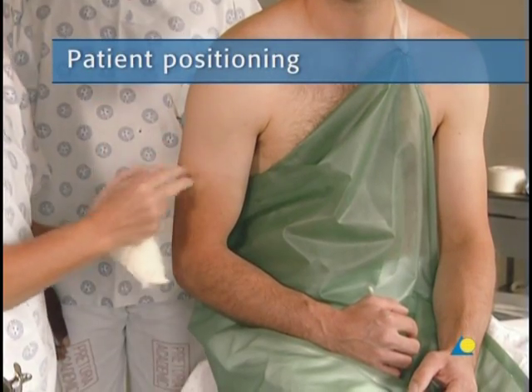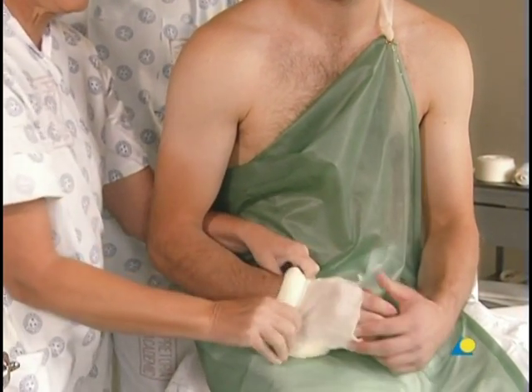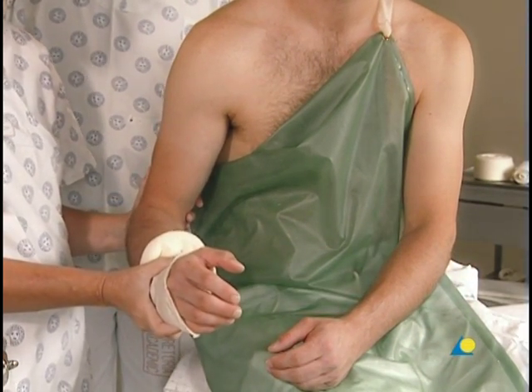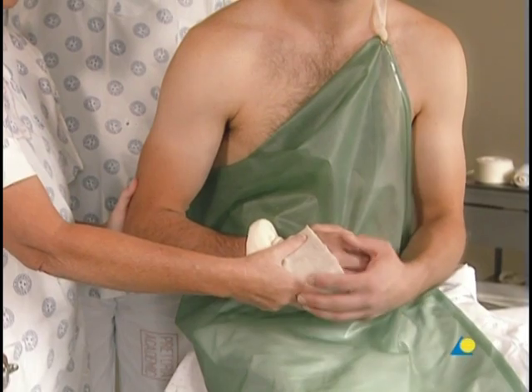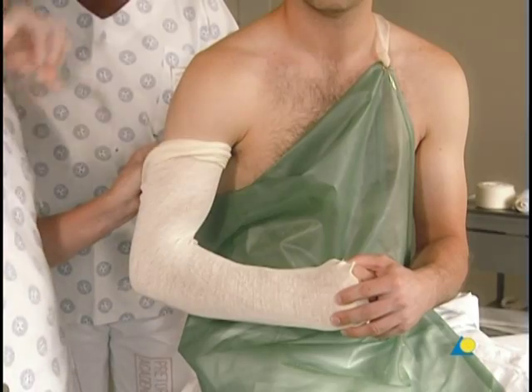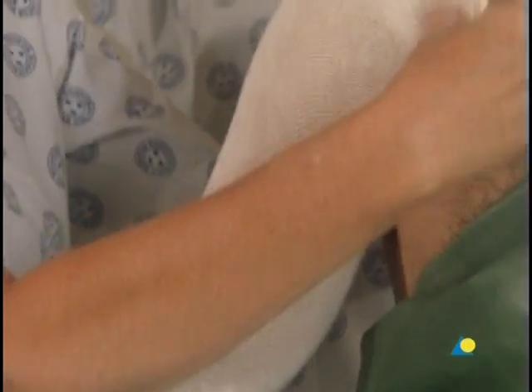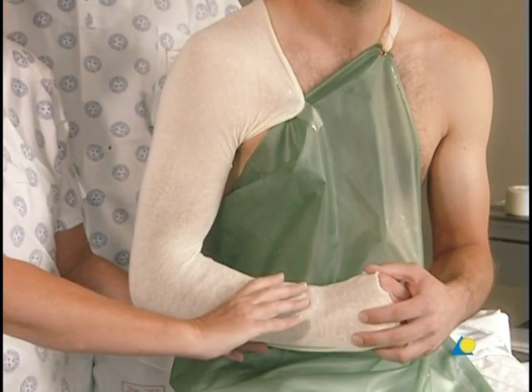The patient should be seated. The patient is told that any feeling of pins and needles or signs of a pinched nerve should be communicated immediately. The splint is applied with the shoulder in internal rotation and the hand in front of the body. The stockinette is applied, and a slit is cut to accommodate the shoulder. The stockinette may be taped in place or held by an assistant. The elbow should be flexed to 90 degrees.